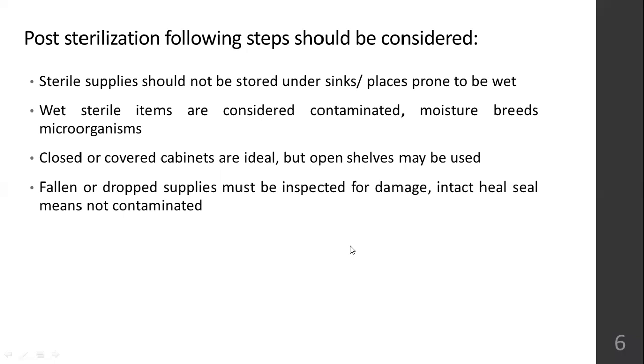If the seal is intact, it means it's not contaminated and it can be used. But if the seal is open, consider that as contaminated.